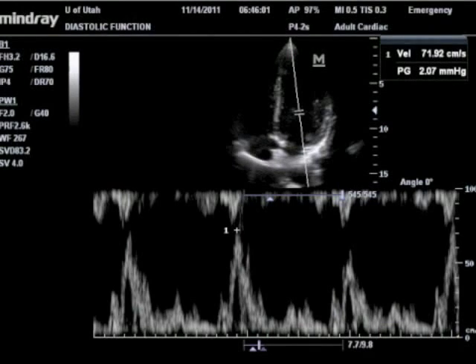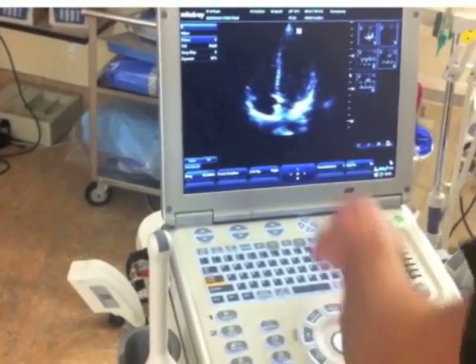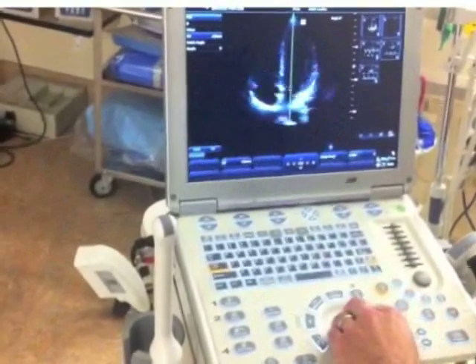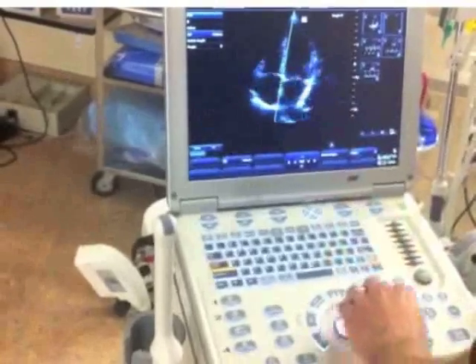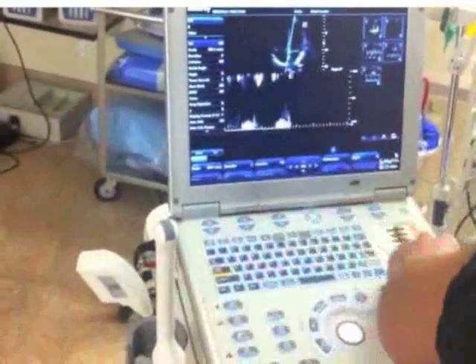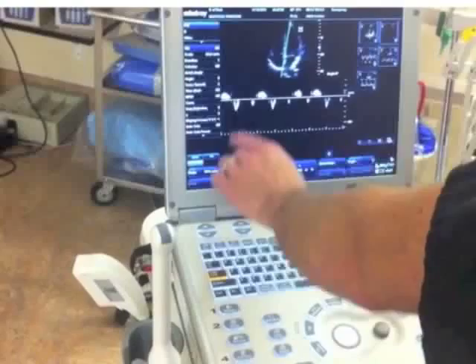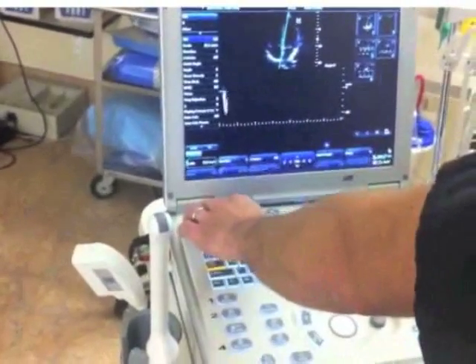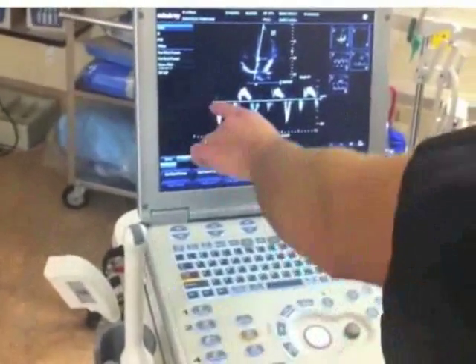The next step is to look at the TDI, because I don't know whether this is normal or pseudonormal. So if I do tissue Doppler imaging, I'll hit the pulse wave again, but now I'm going to put the gate over the annulus, because I'm looking at tissue velocities. I need to turn down my gain, change my baseline, and change my scale to about 20, because most E prime velocities are less than 20.